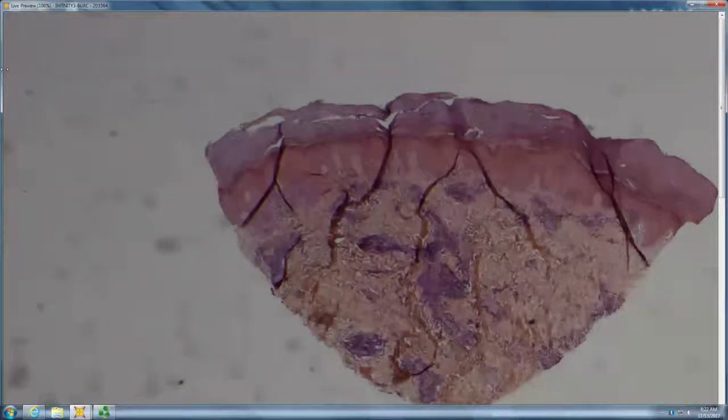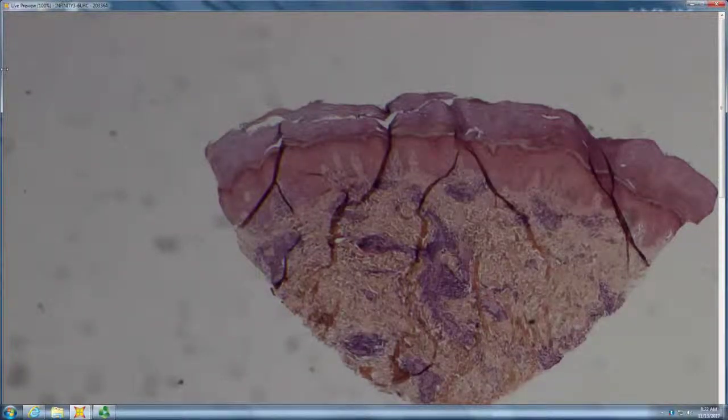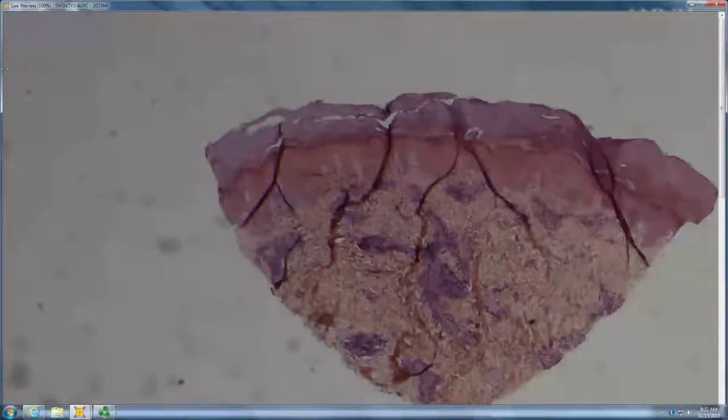I think I'm in the Wells. Yeah, exactly. So that's about as Wellsy as it gets, except that, what are these? Oh boy. Ooh. Churg-Strauss. Yeah, exactly. So this one has some histiocytes around it. You better look at the patient, because this one actually could be Churg-Strauss, right? And so Wells, what horrible things happen to you with Wells? Itch. Yeah, it's about as bad as it gets, right?